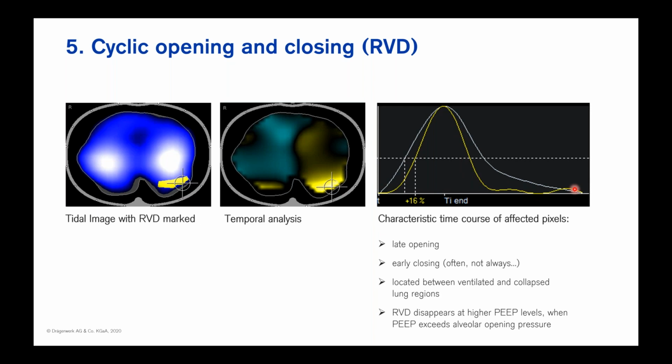And I should also mention that these effects are very much dependent on the PEEP settings, which means if you go higher with the PEEP, you won't see this delay anymore, and that area will be fully opened without a regional ventilation delay. If you decrease the PEEP in such a condition, you probably will achieve a lung region which will remain collapsed during the entire respiratory cycle.